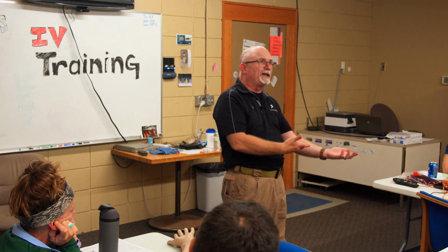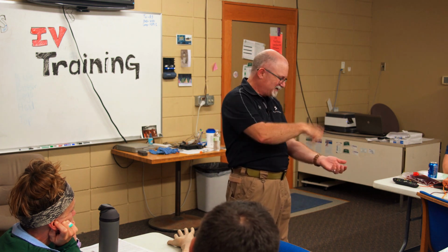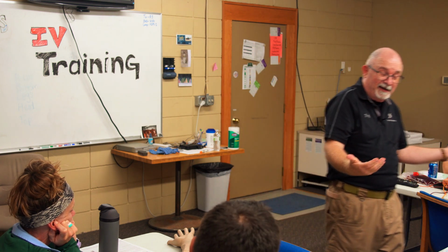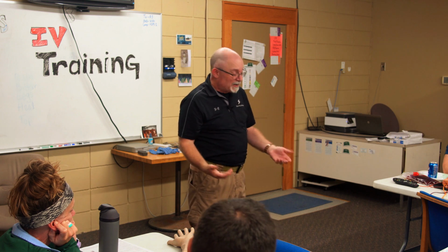I'm going, no, it's totally normal. So we squeezed the bag a little bit. We closed that one off and started one in another place. No big deal. We just had an arterial line. All right, no big deal. It's not the end of the world. Just realize that if you pull that out, now you're gonna have to put some pretty good pressure on it.